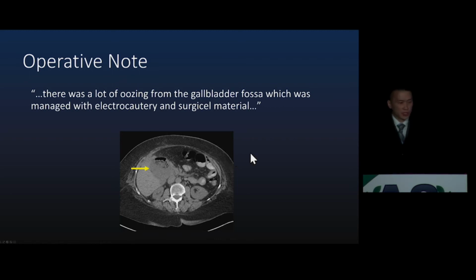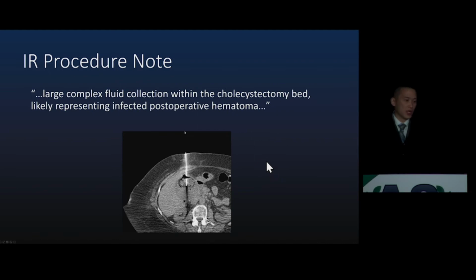So I guess the question is, are we happy because the operative note seems to explain all the CT findings? Well, no, because one, there's this air fluid level here which remains suspicious, and two, the patient is symptomatic. So this goes on to IR drainage, where they're found to have an infected postoperative hematoma.